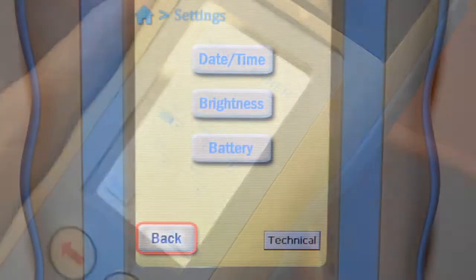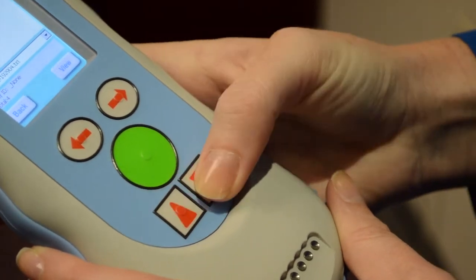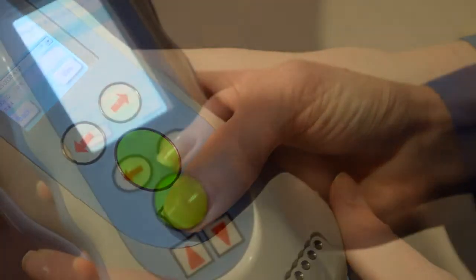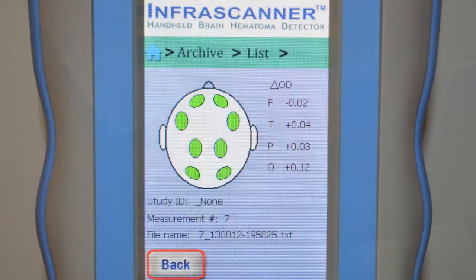The technical button on the lower right is for technician use only. The archive screen is where measurements are stored. Select view and use the up/down arrow keys to select the scan to review. The scan measurement will show the number followed by year, month, day, hour, minute, and second. When a measurement number is selected, the head diagram along with a relative optical density number at each measurement point can be reviewed.